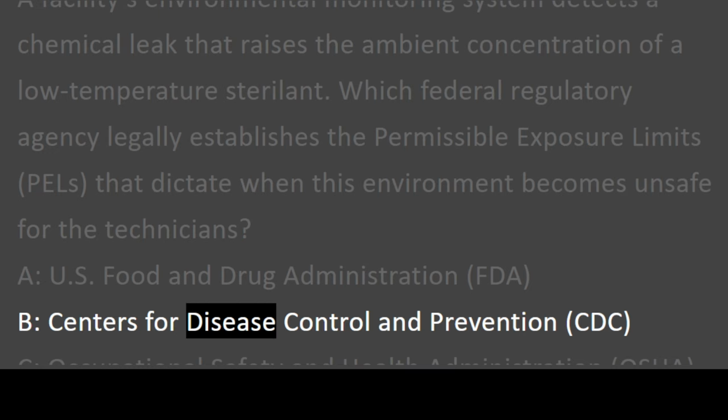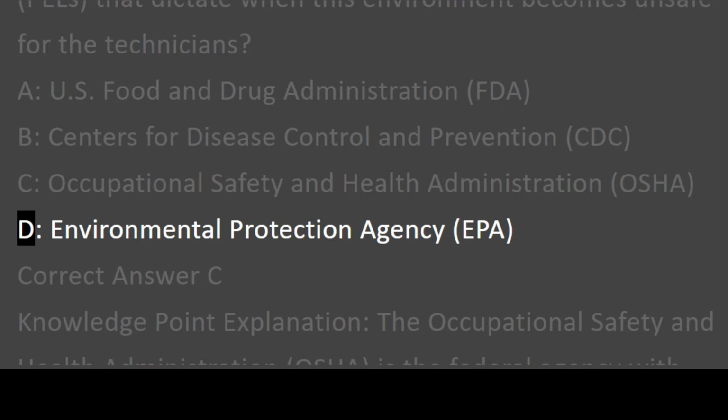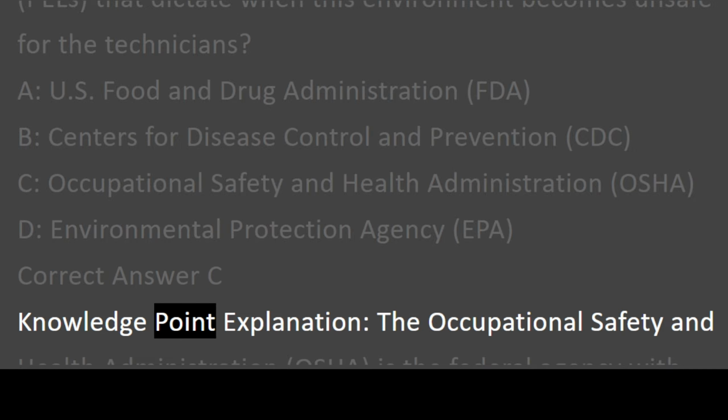B. Centers for Disease Control and Prevention, CDC. C. Occupational Safety and Health Administration, OSHA. D. Environmental Protection Agency, EPA. Correct answer C. Knowledge point explanation.